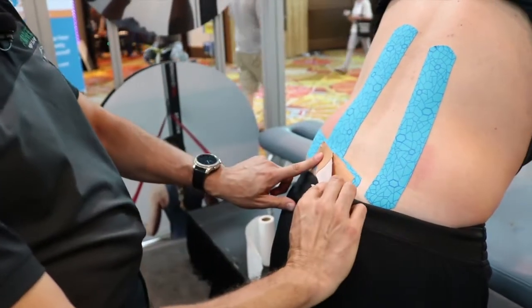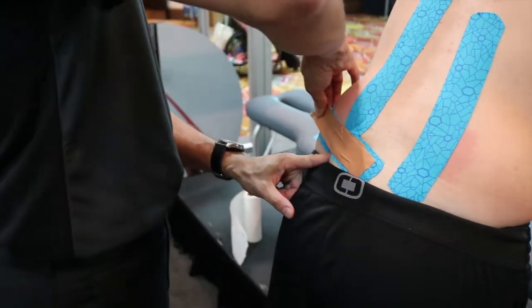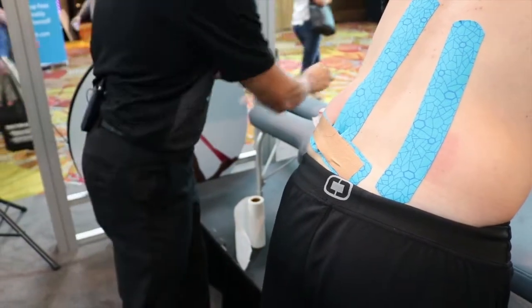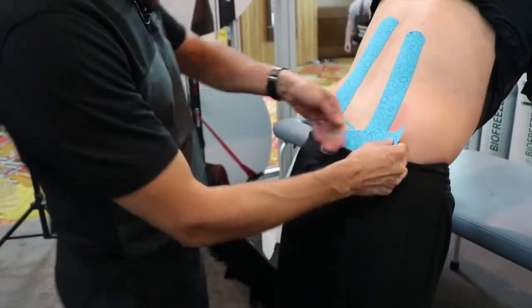We're going to place our finger just in front of that tab, about a quarter inch. And now we're going to pull the tab right over our finger. And you're going to see a little convolution that develops right on the skin. We'll put our second strip down. I always try and cover the edges of the first strip.